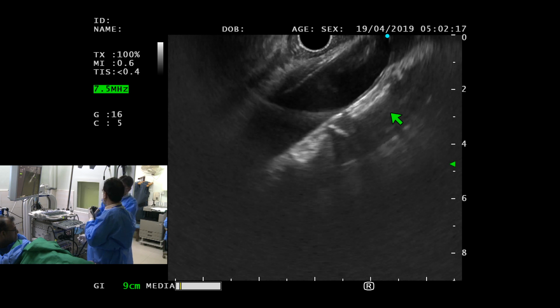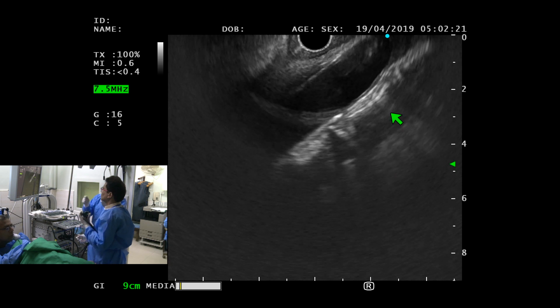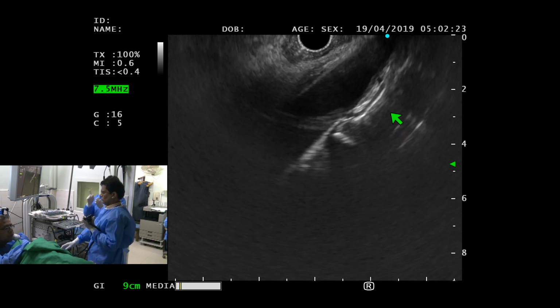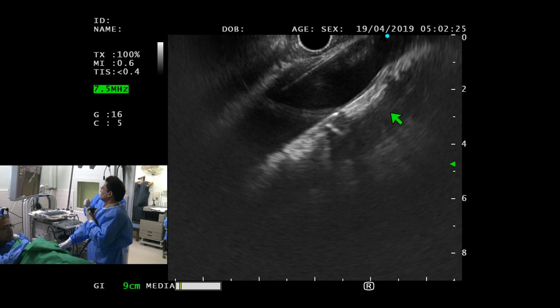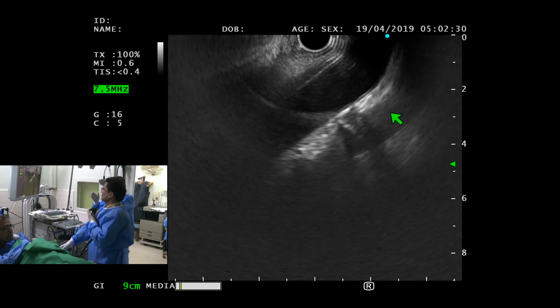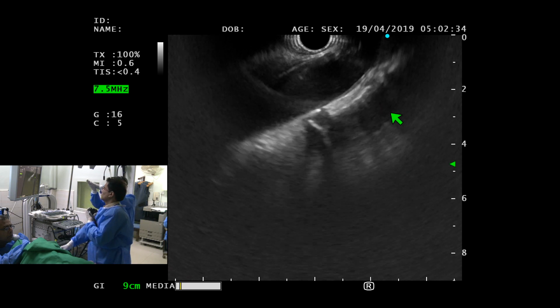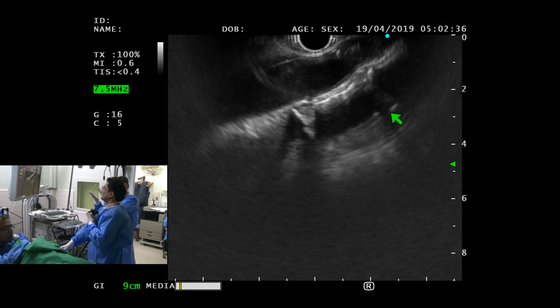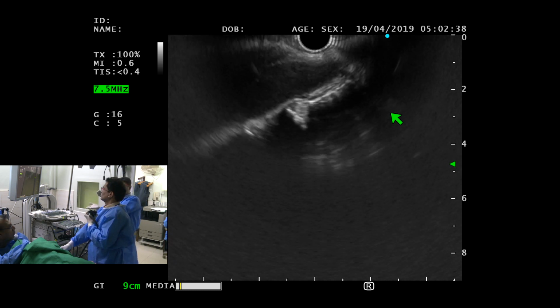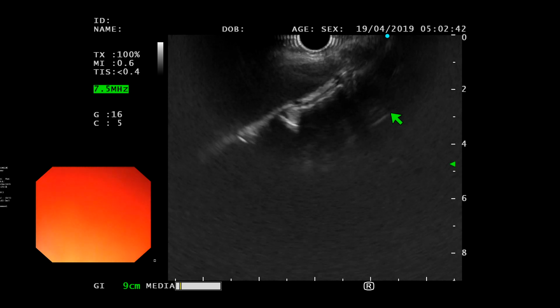So your left hand in EUS, it starts to relax as you get resistance in the right hand. However, हमें पता है एक और चीज़ का कि अगर हम left जाएंगे, so we might lose aorta position. So to counteract that, your big wheels start to come towards you a little because then you kiss the mucosa at all times. So you use your big wheel to keep against the mucosa and you then relax your left hand to go through GOJ. And let's just do that now.